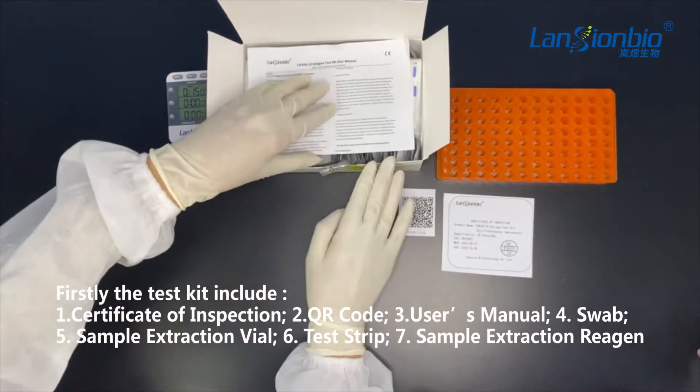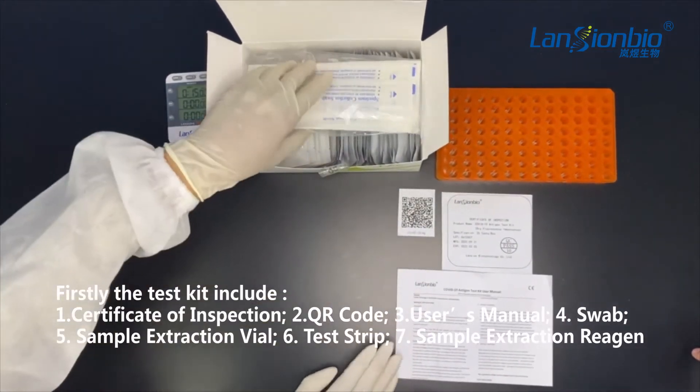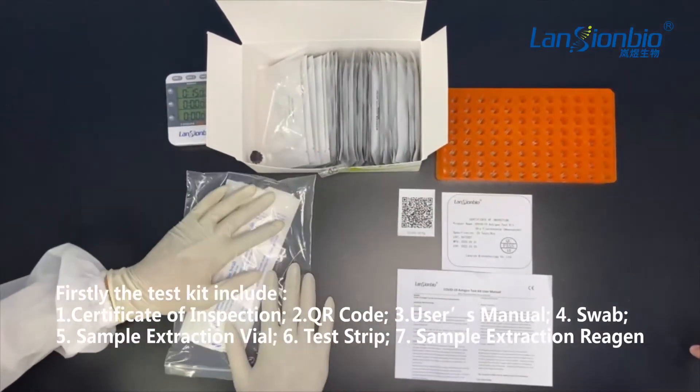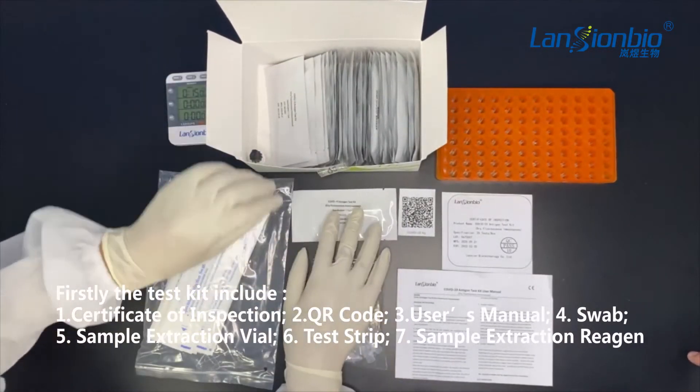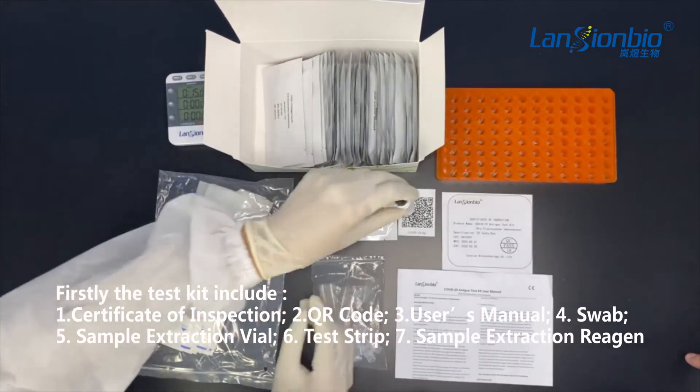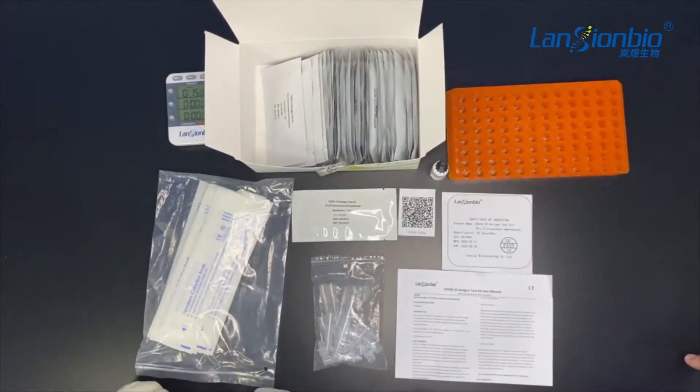Firstly, the test kit includes a certificate of inspection, the QR code, user's manual, swab, sample extraction vial, test strip, and extraction reagent.